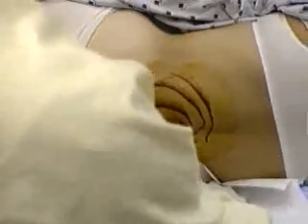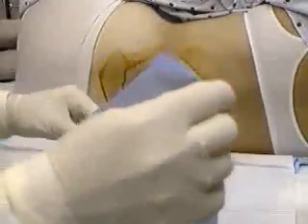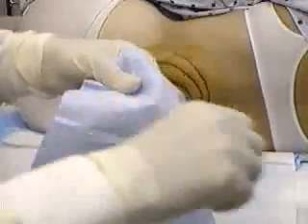Slip a sterile drape under the patient. You won't contaminate your gloves if you allow a portion of the drape to fold over your hands. Pre-packaged spinal trays contain a fenestrated sterile drape. A strip of paper protects a line of adhesive on this drape. Peel away this strip. Cover your patient's back with this drape, aligning the opening in the center of the drape over your proposed puncture site. Firmly press the adhesive on the back of the drape against your patient. Adjust the drape appropriately.